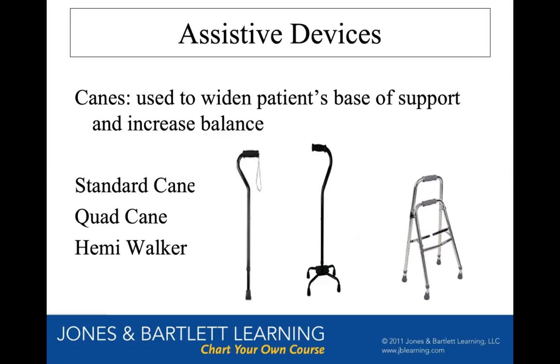There are times when those are available, and we do have them in our lab to see, but you just get better quality training if you use something like a quad, a regular single point cane, or even a walking pole or a walking stick, like a hiking pole.